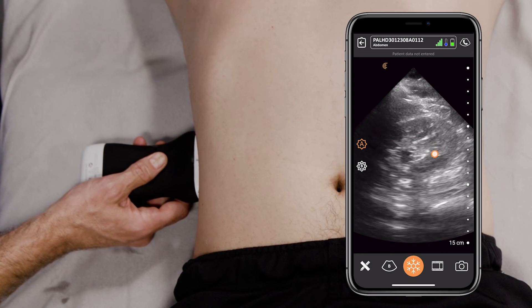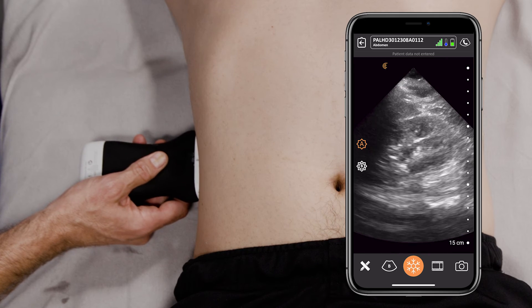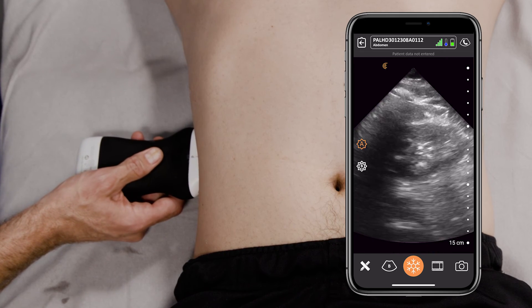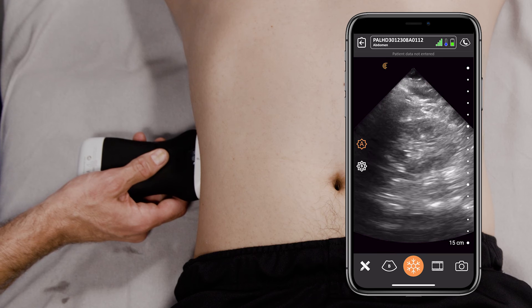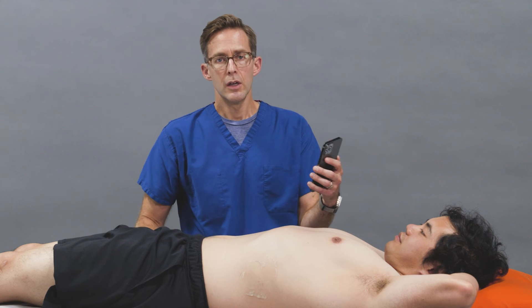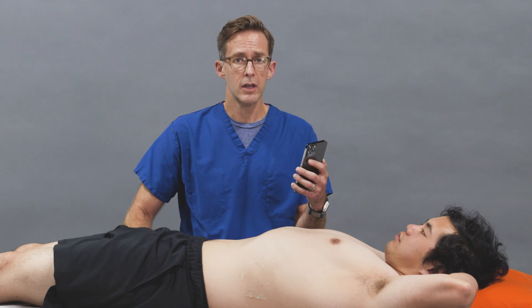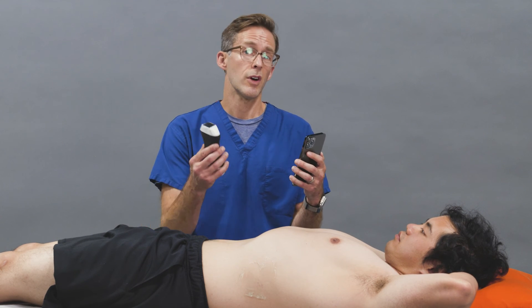And we're looking at that pelvis — we see it nice and bright. The renal pelvis is not hypoechoic, so we see no hydronephrosis on this side as well. And we scan through. So if a patient comes in with flank pain, you can easily take your ultrasound probe and evaluate for hydronephrosis at the bedside.